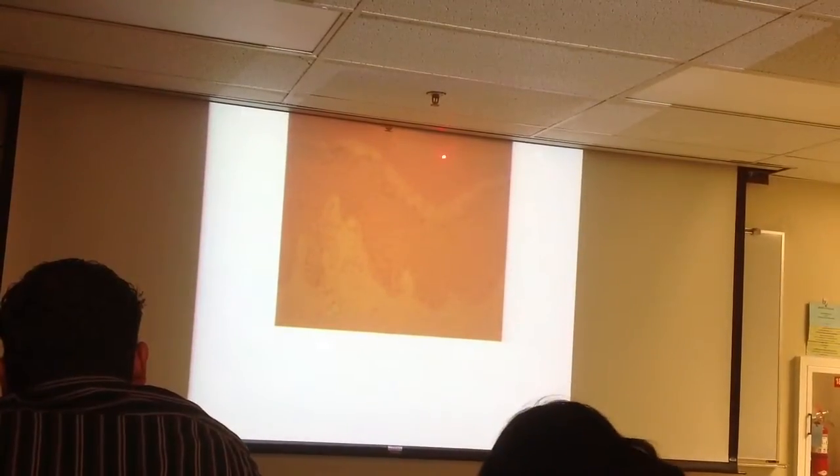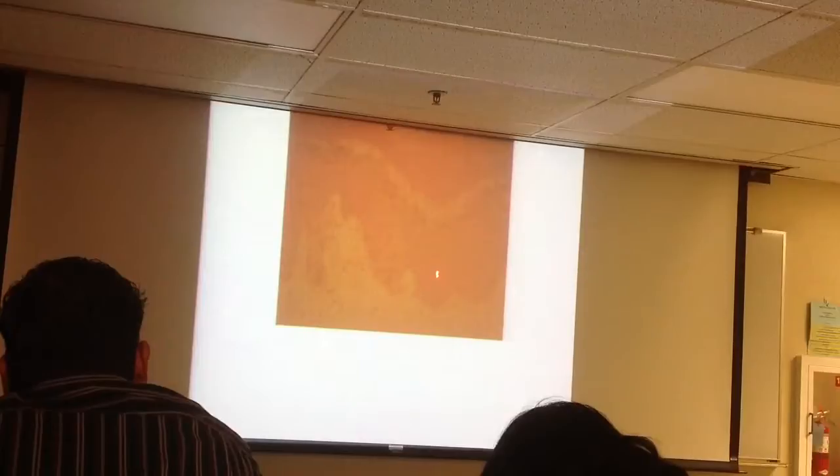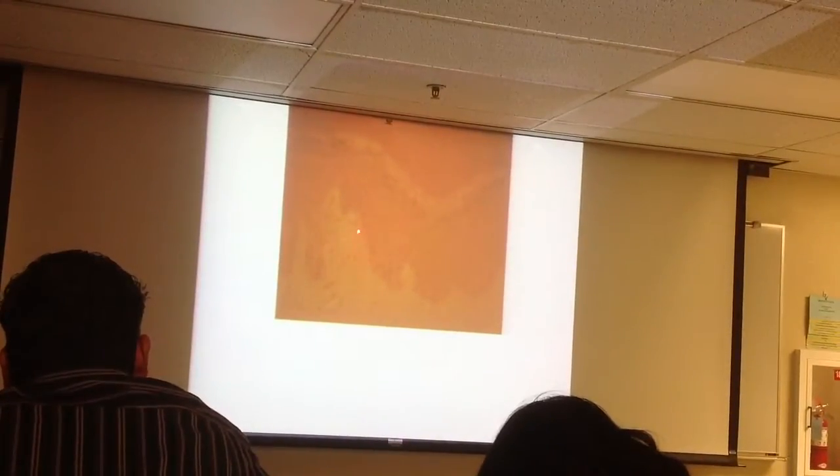What's this specific layer? Stratum corneum, stratum lucidum. Just barely can you see the grains, but stratum granulosum. And down here, stratum germinativum. Then you're on the basement membrane. Then you start dermis. This part up here is the papillary layer of the dermis. That's the reticular layer.